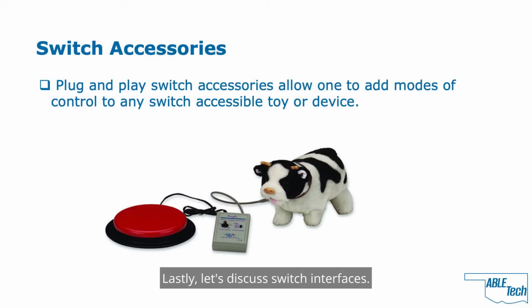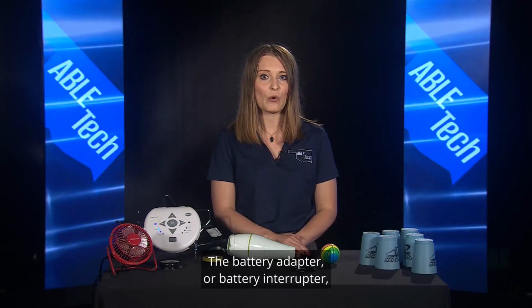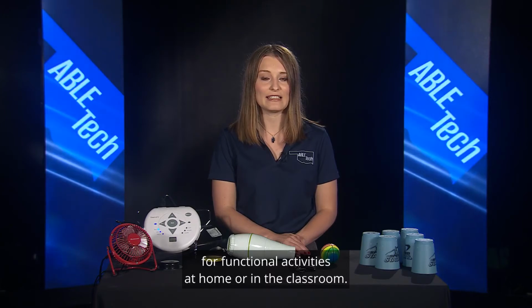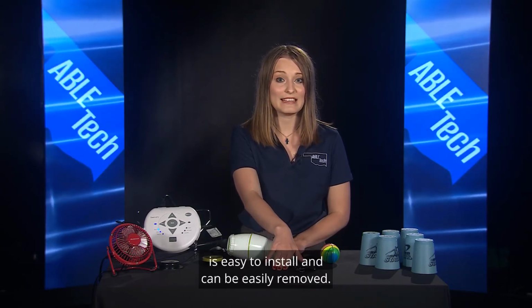Lastly, let's discuss switch interfaces. A switch interface is a device attached between the switch and the toy or device you want to control. There are several switch interfaces available to enhance and extend switch use. The battery adapter or battery interrupter converts any one-function toy or appliance into a switch-activated device for functional activities at home or in the classroom. The battery interrupter is easy to install and can be easily removed.